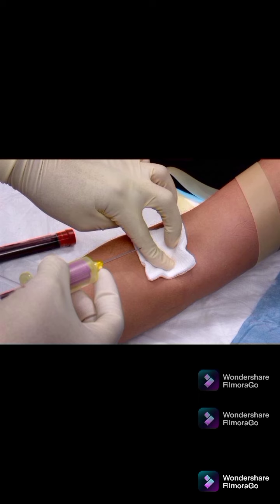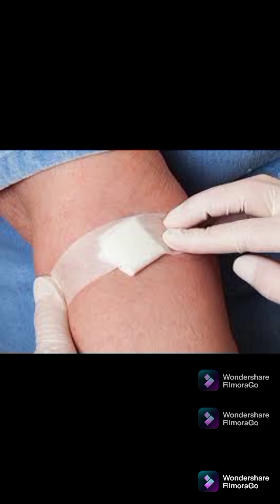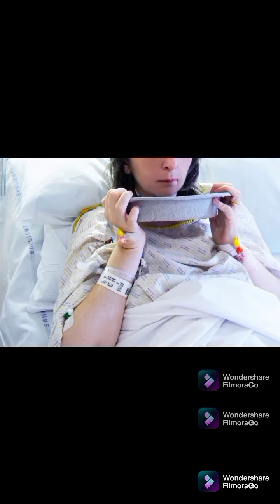There are some patient complications and conditions you could encounter during or after performing a venipuncture. One of these is excess bleeding. Some patients who are on aspirin or anticoagulant therapy may take longer to stop bleeding. Be sure to maintain pressure over the site until blood stops.